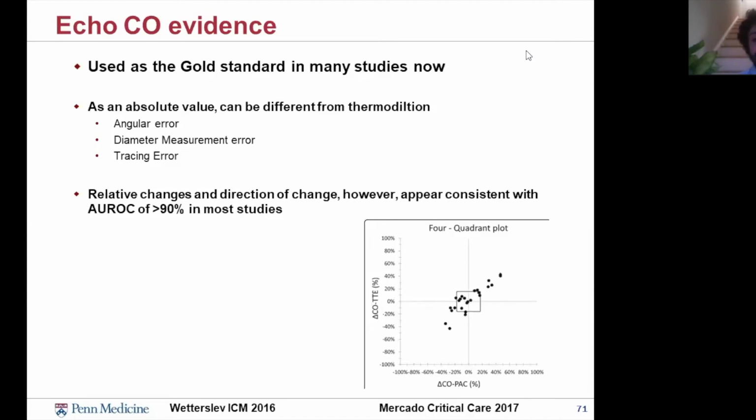One of the things that some people will recommend is the transesophageal echocardiography. And this is not available everywhere, and I know that, but it fixes the problem of obesity. And so in some of our intensive care units, we've started to move towards that for a truly obese patient. We have patients with body mass indexes that are greater than 60, where it's impossible to get a transthoracic echocardiogram. That being said, if transesophageal echocardiography is not available, then you have to use the windows that are.